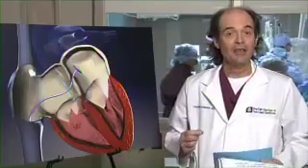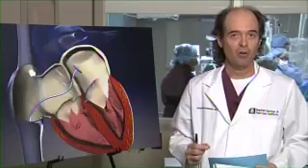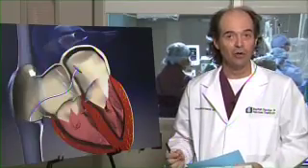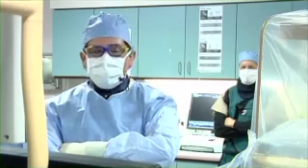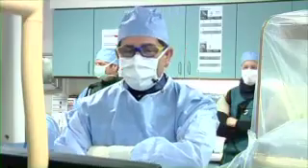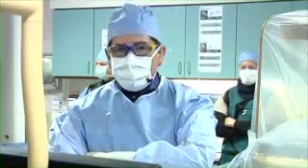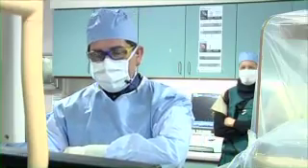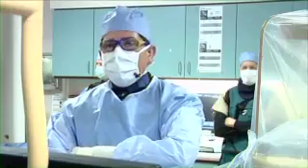Somebody asked, is there any other therapy for a patient with a stroke with a PFO, and is it as good as a closure device? That is a very good question. Yes, there are other therapies available for patients with a stroke, and one is the use of antiplatelet therapy and the use of anticoagulation with Coumadin. That is as comparable as using closure.